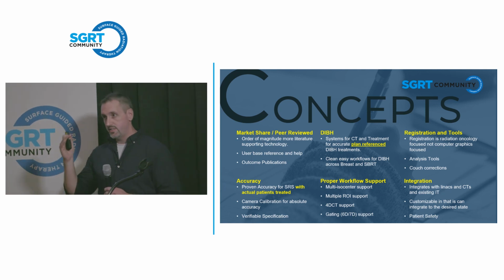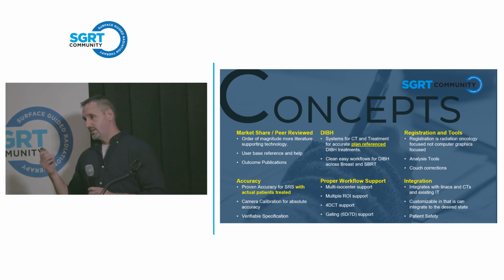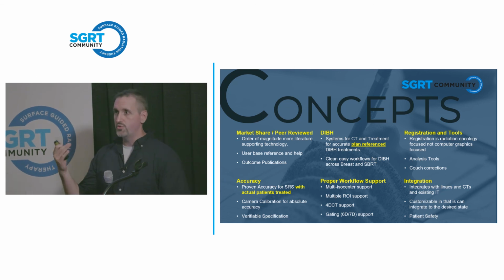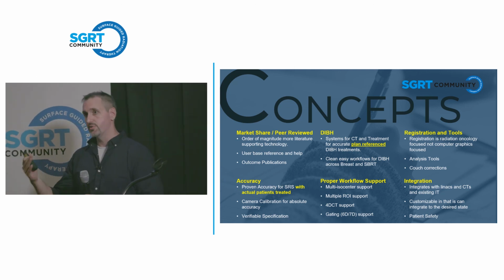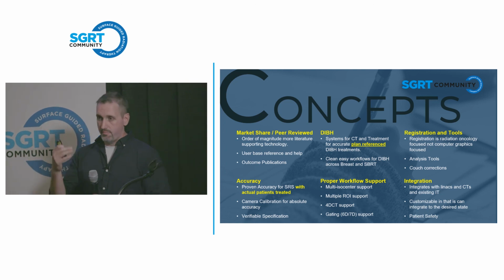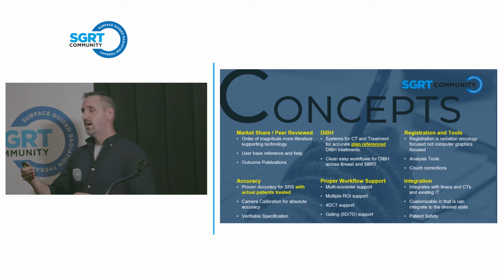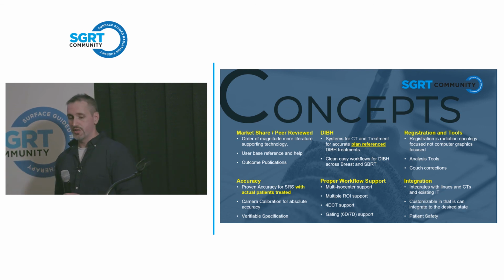Customizable to the level that you want it to be customized. Think about what your workflows are, think about the patient safety concerns that you have and how you want it to integrate into your network and into your machine and into your workflow, and make sure you're testing those points repeatedly. Make sure you understand the QA that's needed to make sure that all of those integration points are checked.